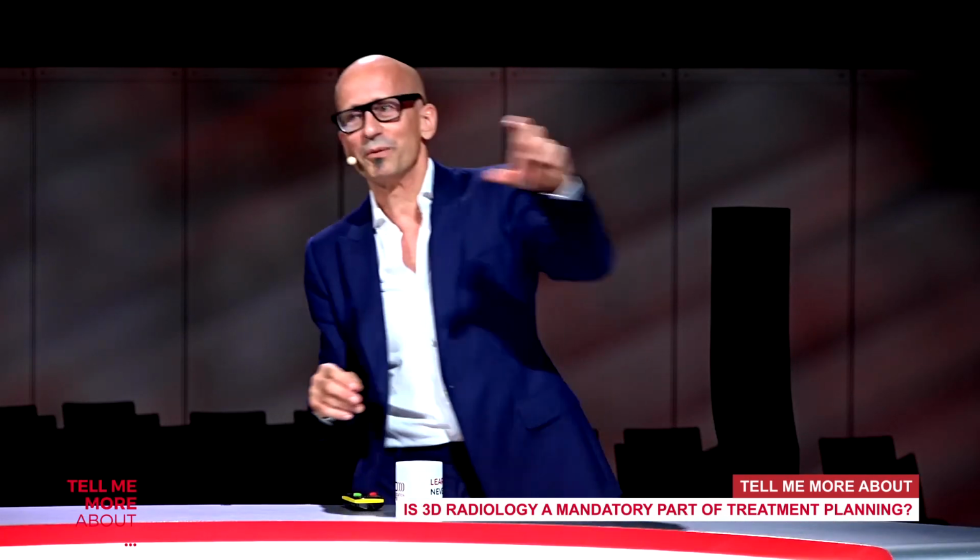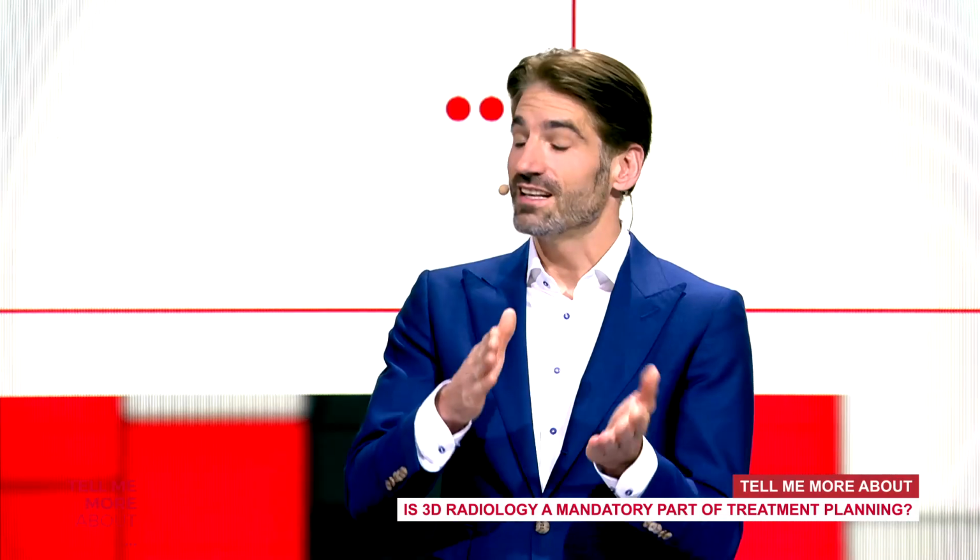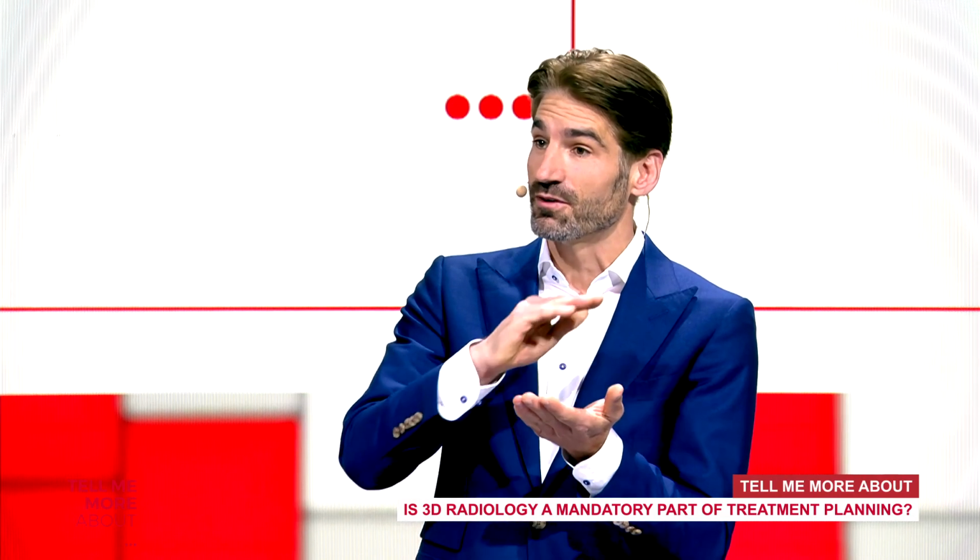That's a lot. If you have 5 millimeters of bone and you want to place a 5 millimeter implant, then you have to go as close as possible to the nerve. There, you cannot rely on all the technology. You cannot place your implant on top of the nerve. This is not possible. There is no technology, even when we go a step further, to the robotic one. At the moment when we look at technology, and I personally think it will never happen, because there, the CBCT alone has already failed. Right? Yeah, because that's what's happening. There are little tolerances in every step of the phase, and every step adds up.